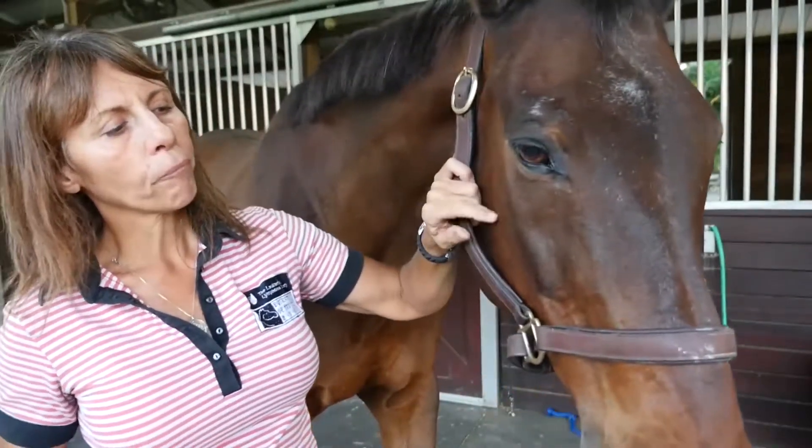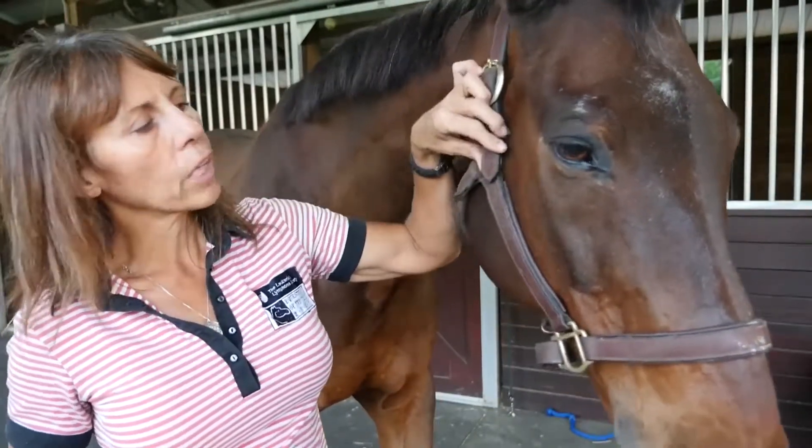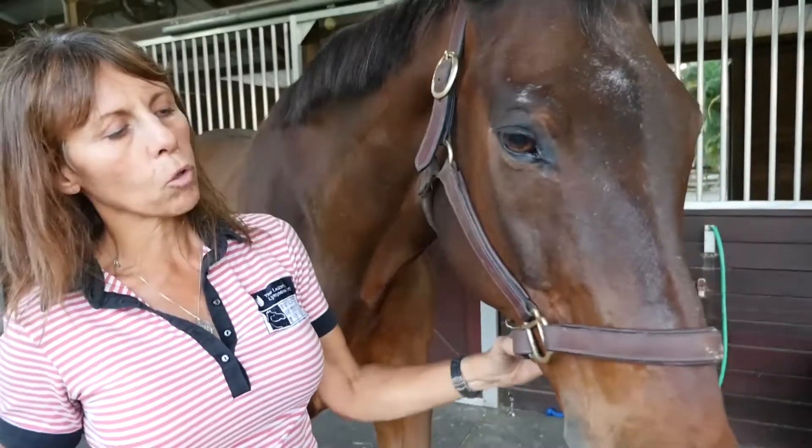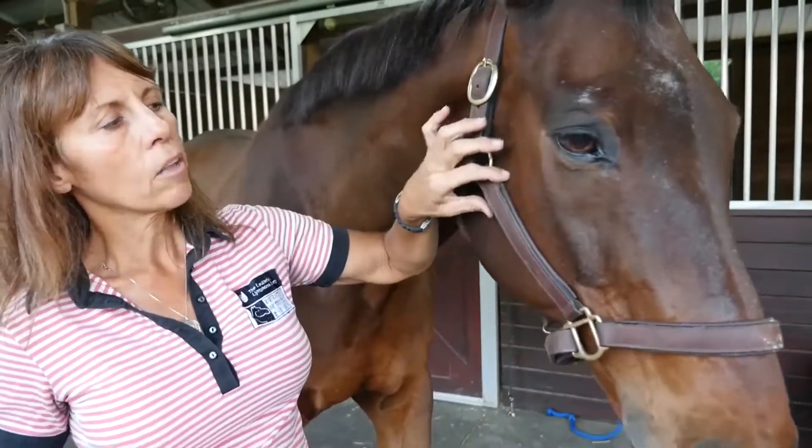A lot of areas where we get nerve irritation is from the halter on a surgical case, or from a halter in the field that's grown up into it and then has pressure on the facial nerve.